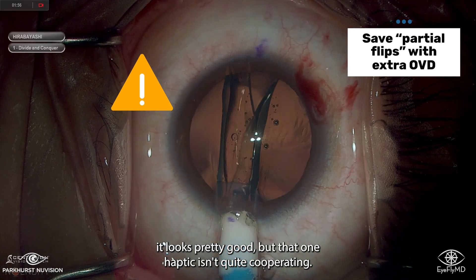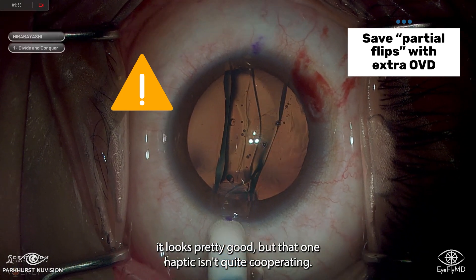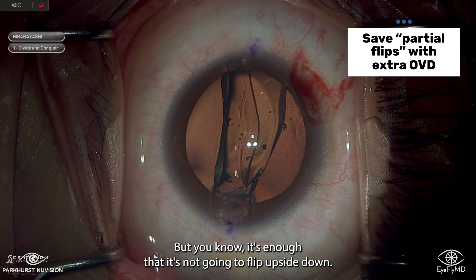To prove that's a pretty effective measure: here's another example where it looks pretty good, but one haptic isn't quite cooperating. Even so, it's enough that it's not going to flip upside down.